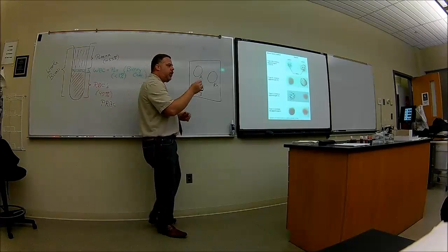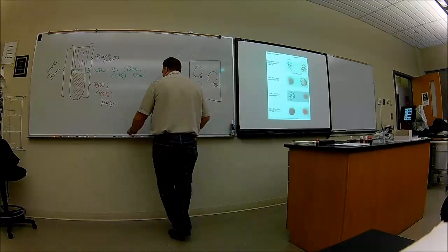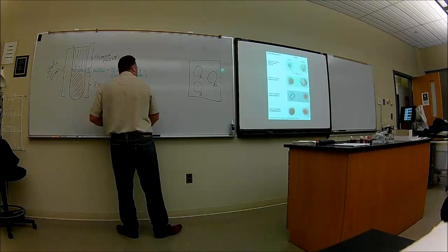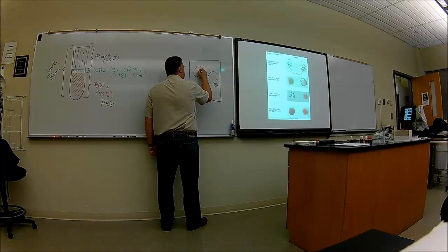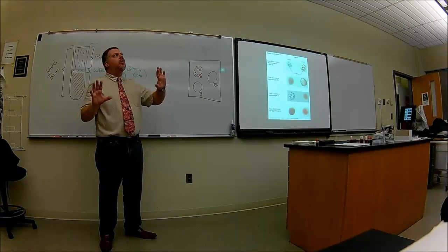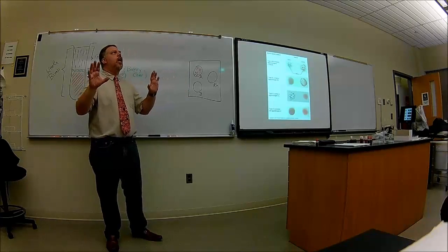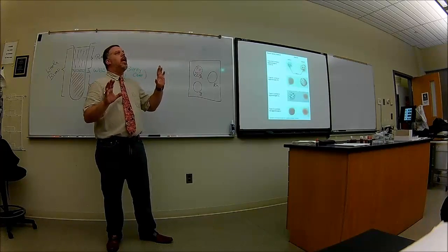So you're going to put 1 drop of blood in that A. And lo and behold, in this particular instance, when you put a drop there, you're going to see kind of like that. Because the antibodies to A are looking for that antigen to A, and you put a drop of blood in there, whoop, and it sees an antigen to A.